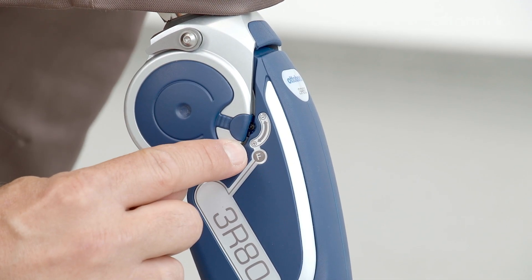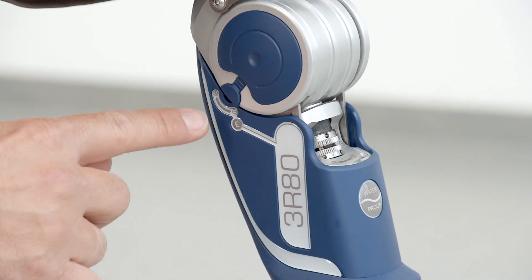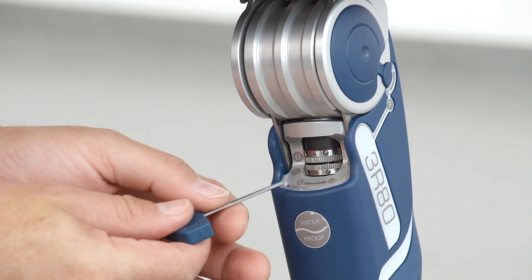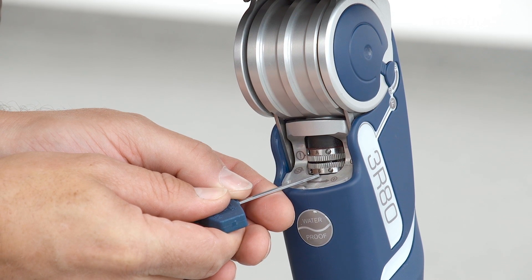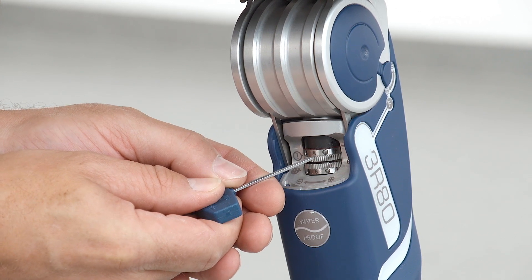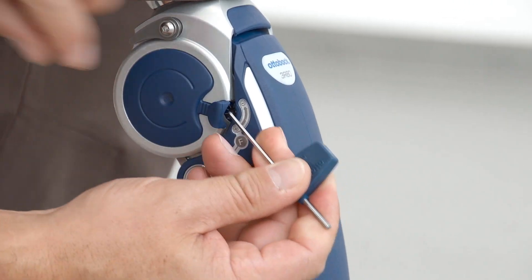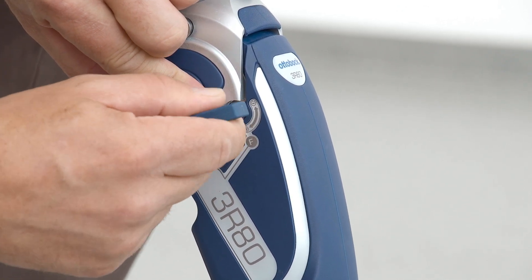Both flexion and extension damping are independently adjustable. Before fitting the user, please check the factory settings. The corresponding values can be found in the instructions for use. The upper adjustment ring should be set at zero clearance.